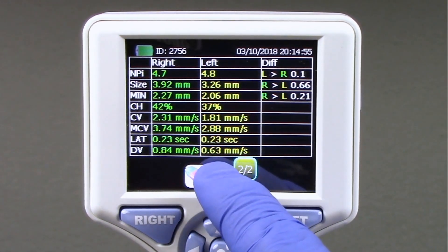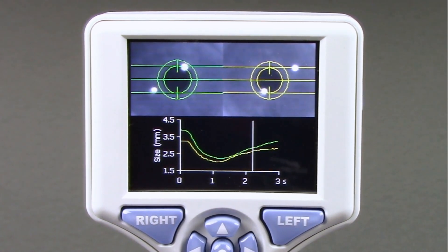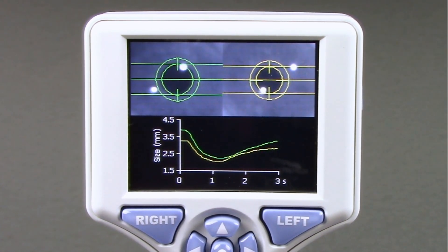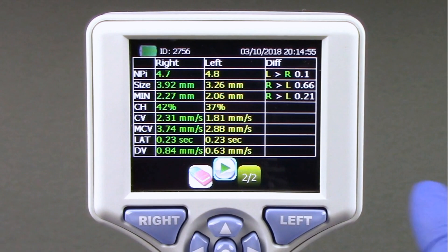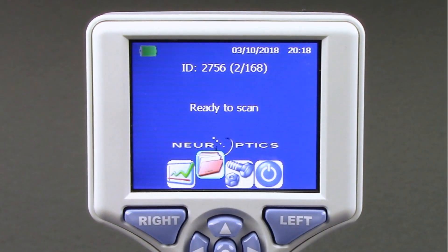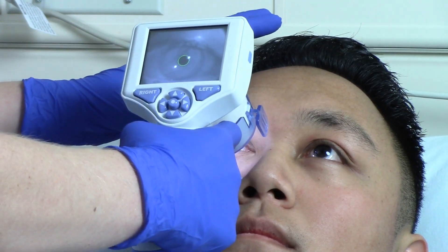From the results screen, while patient data is displayed, a video playback of the pupil response can be accessed by pressing the green arrow button on the touch screen. The pupilometer will store and display only the video from the last measurement. After taking a measurement, you can return to the home screen of the pupilometer by pushing either the right or left button on the keypad.